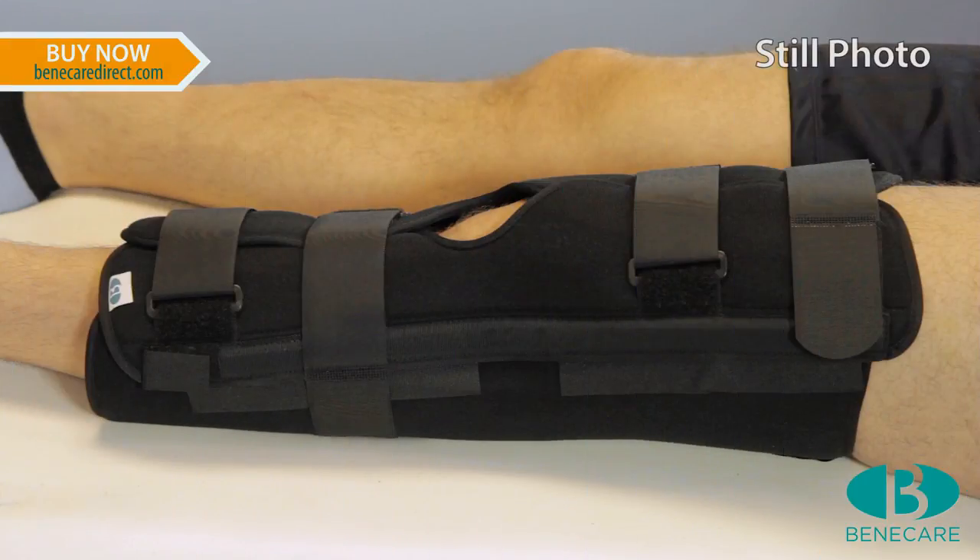The splint should fit approximately 10cm from the groin and 10cm above the ankle. Choose the appropriate size splint suitable for the length of the leg.